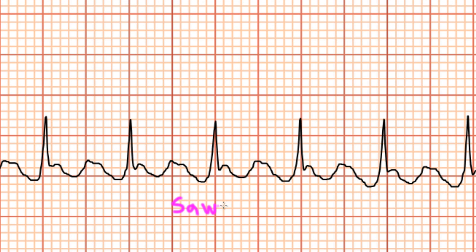This EKG is an example of atrial flutter. If you look closely, you can see these sawtooth flutter waves down here. And if you look even more closely, you'll notice that there's a flutter wave buried at the end of each QRS complex. That means that there's only one box separating each consecutive flutter wave, giving us an atrial rate of 300 beats per minute.